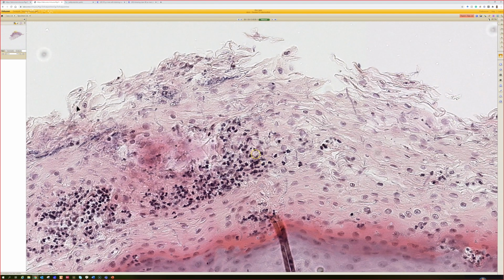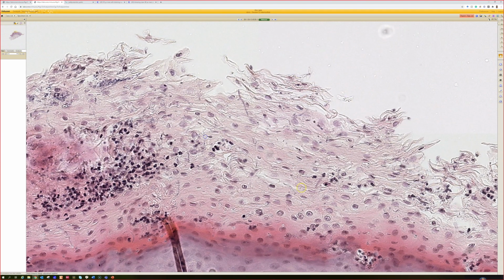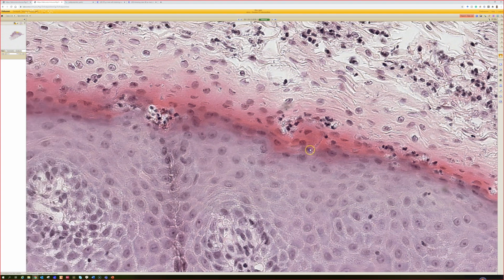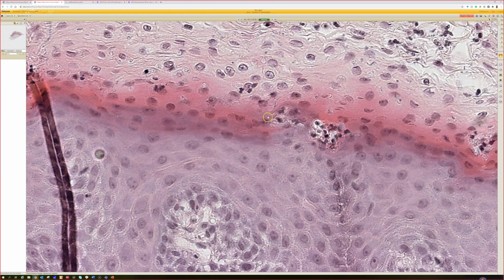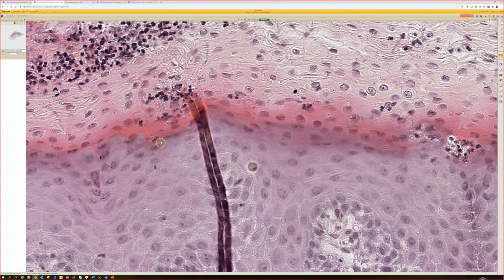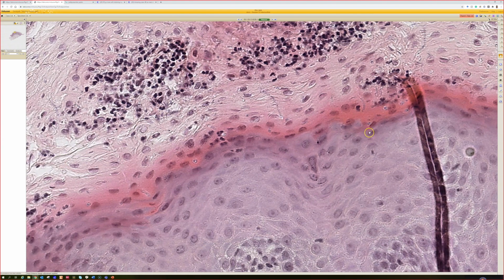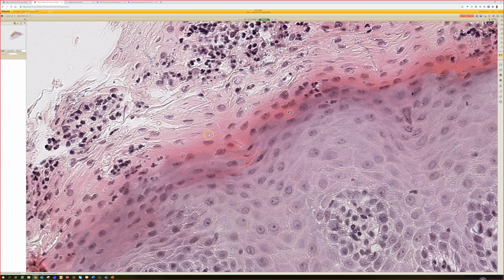And one other thing that really helps me is when I see the hyphae, sometimes you can see them actually pierce into the viable portion of the superficial stratum spinosum, okay? And that actually on cytology, like from cervical cytology, like a pap, when you see Candida there, you tend to see Candida kind of skewering and stabbing through multiple keratinocytes. And I think this is kind of analogous to that. I feel like you do not usually see dermatophyte fungus grow down like this, whereas Candida, sometimes you will see it, but not always, okay?